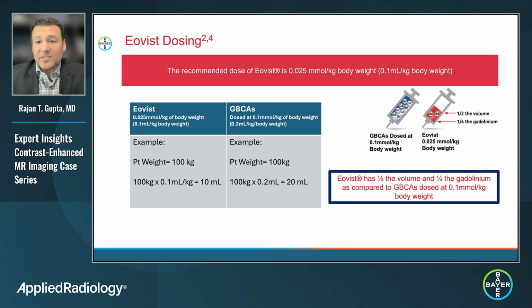It's important to have a method to easily calculate appropriate dosage. If your department uses multiple contrast agents, it might benefit your team to have a clearly defined dosing chart.